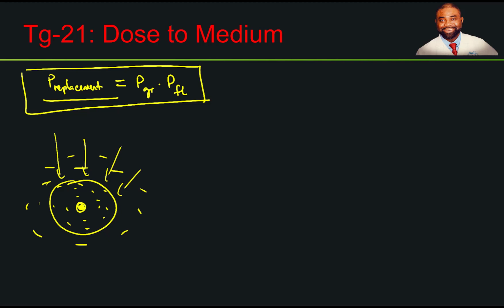But what you need to keep in mind is that the dose is deposited upstream from the center of the chamber, which implies that the electron fluence in the cavity is representative of the fluence in the medium at some point closer to the source, because there is less attenuation or build-up in the cavity than in the medium. This is corrected with what we call the gradient correction factor.